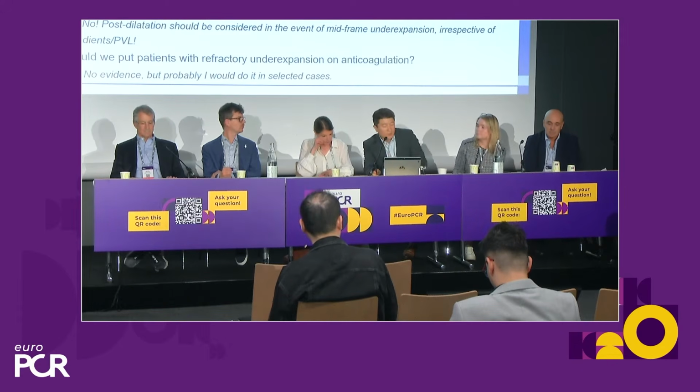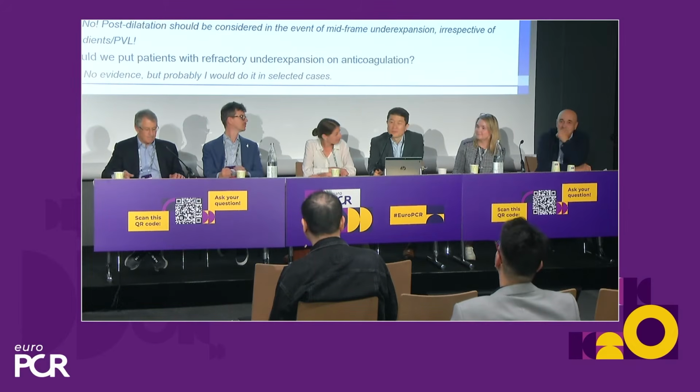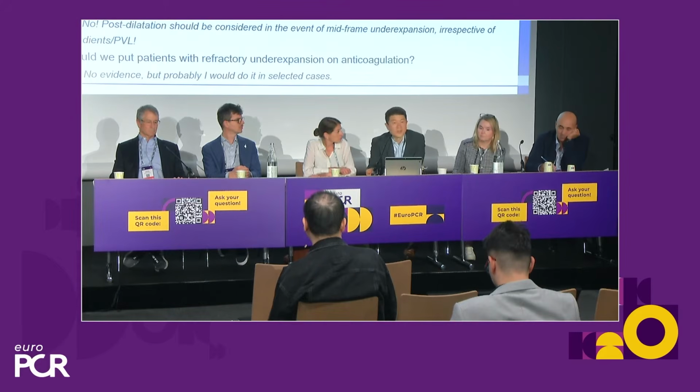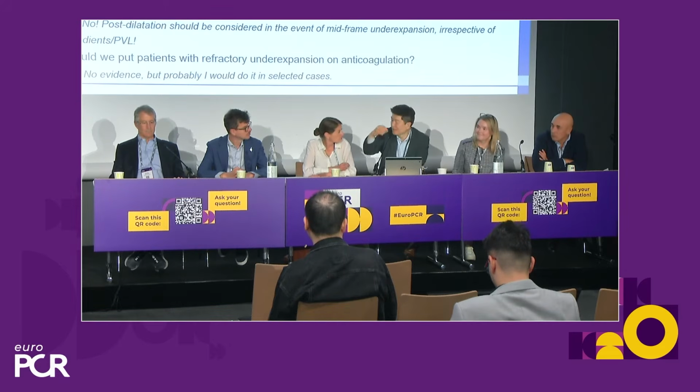Yeah, I absolutely agree. So I can still implant a valve, and of course we first look at expansion. If I have the feeling I have to post-dilate, and there are many criteria, I address inflow under-expansion, but also mid-frame under-expansion, and you can go to different angulations, depending also on the calcium load of the individual patient and how the valve behaves, how it was pre-dilated, post-dilated, etc. But actually, if I have the feeling there is some under-expansion, I immediately go for post-dilatation because I'm too lazy to put the catheter in and do the pressure tracings.